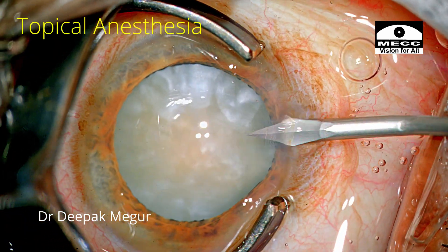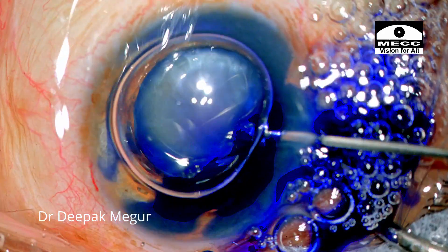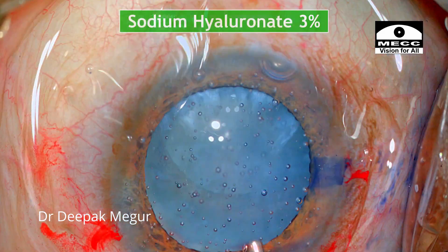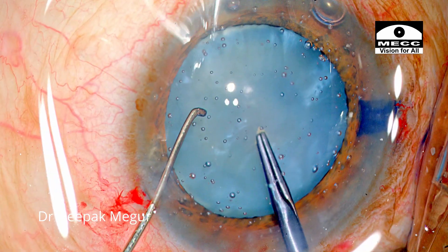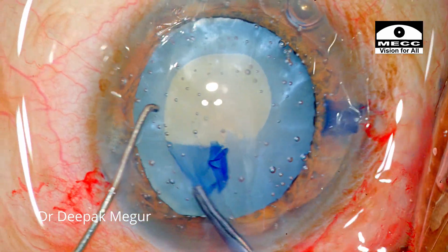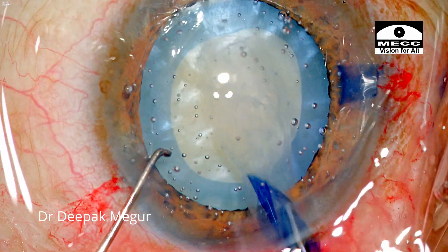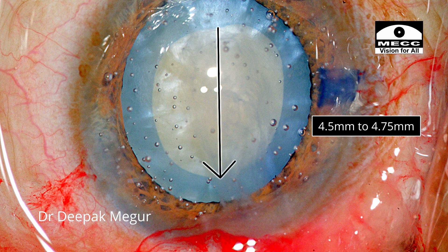Let's begin with the first case. This is an 80-year-old elderly man with an intumescent cataract. The capsule is stained and I am using cohesive OVD — sodium hyaluronate 3% in this patient. These air bubbles are quite irritating, but I need to just ignore them and proceed with the surgery. Since it was an intumescent lens, I am avoiding making a very big rhexis. My rhexis is slightly lesser than what I would have personally liked — it's around 4.5 mm to 4.75 mm.